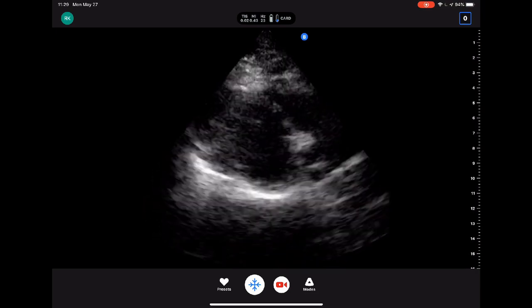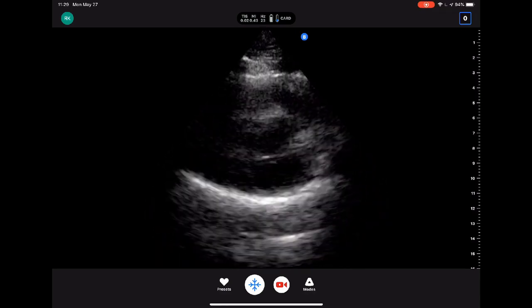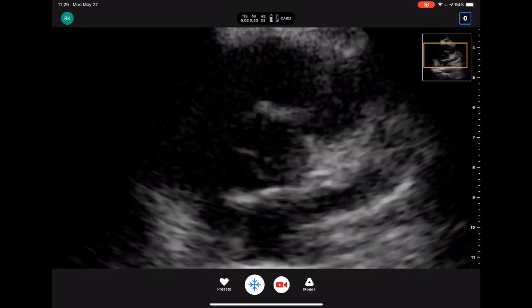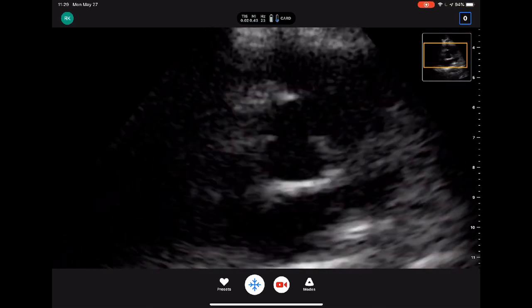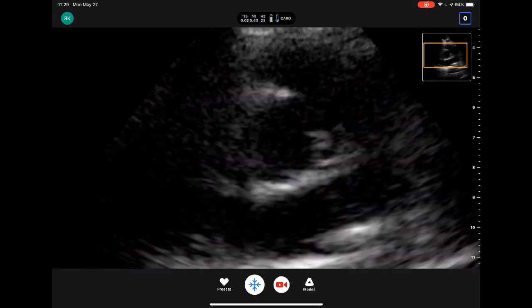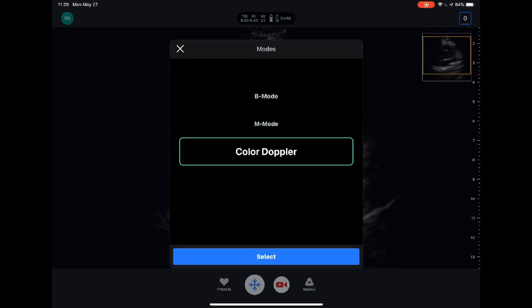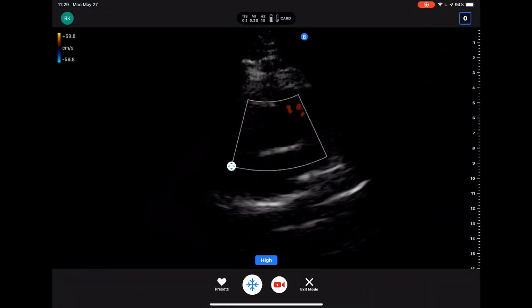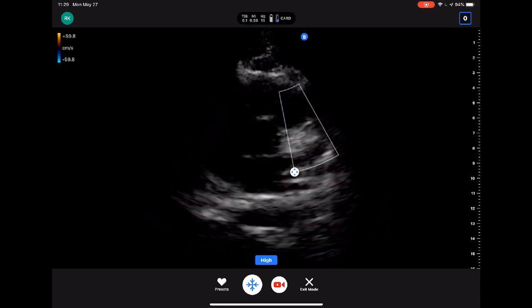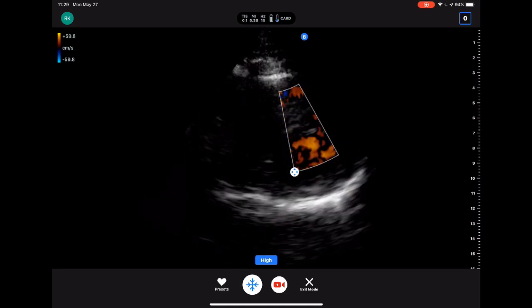I can switch by rotating here, going to the parasternal short view. I'm running out of gel, but I'm going to swipe up towards my aortic valve — you can see me zooming in here, and it looks tri-leaflet. I did this exam earlier so I'm pretty sure it is. You can even look at other parts of the heart — over here I can look towards my pulmonic valve. Tricuspid valve would be on the other side.